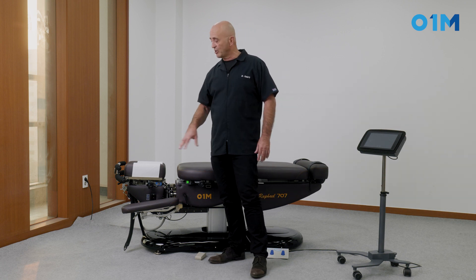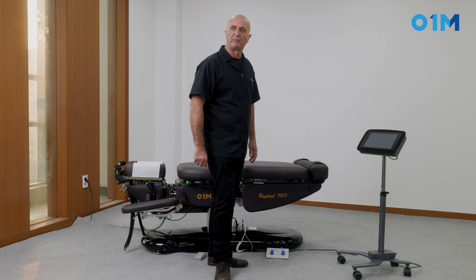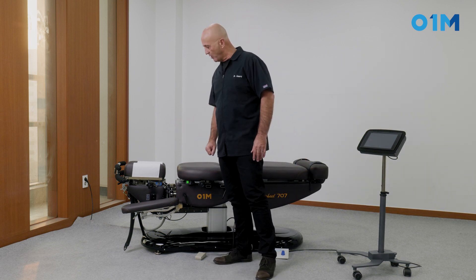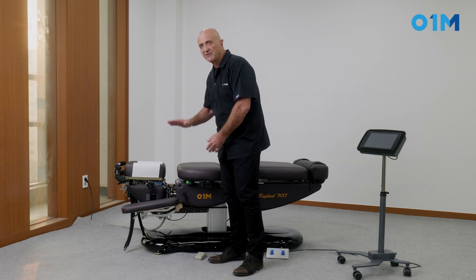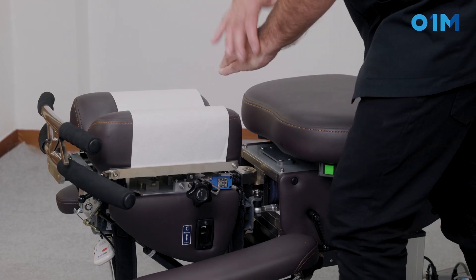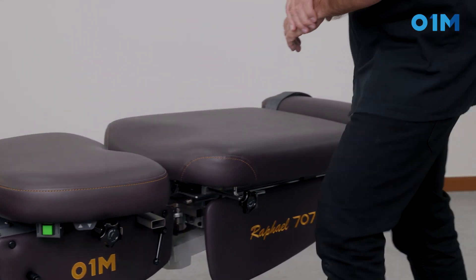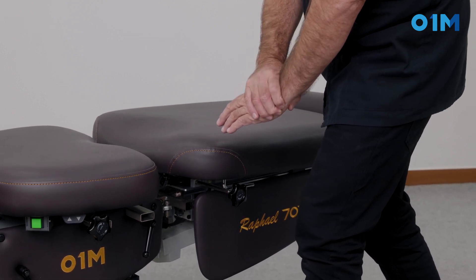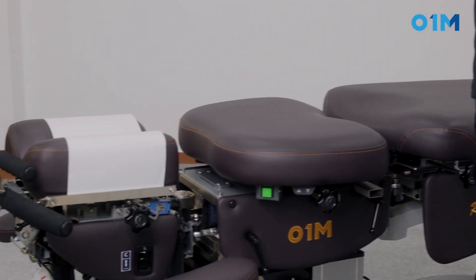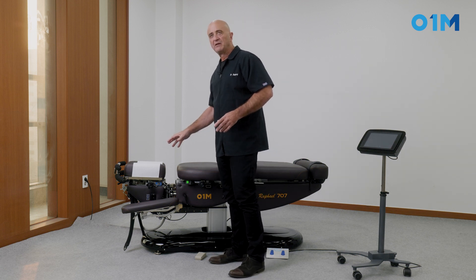There are different types of drops. We have the toggle recoil drop, like in the cervical, and we have what we call the sustained drop, like the pelvic drop. The thrust mechanics are different: in the toggle recoil, the thrust does not reach the down section of the drop — it stops before and recoils before the bottom. In a sustained drop, you go all the way down and do not recoil. Those are the main differences between the toggle recoil and the sustained drop.